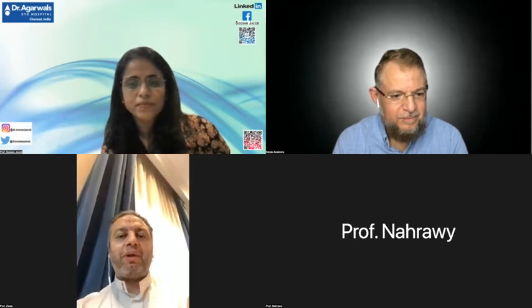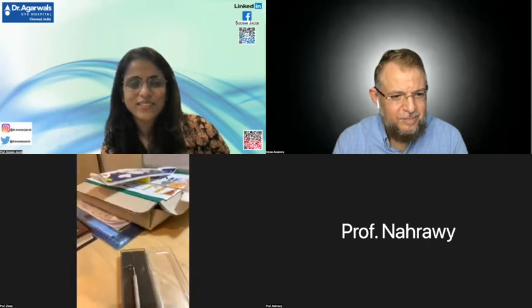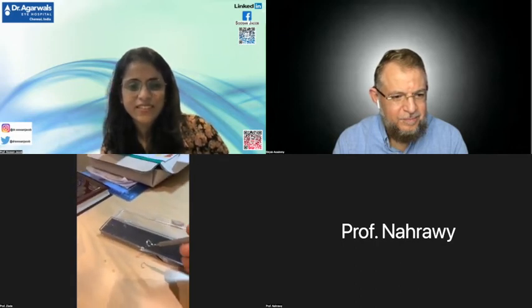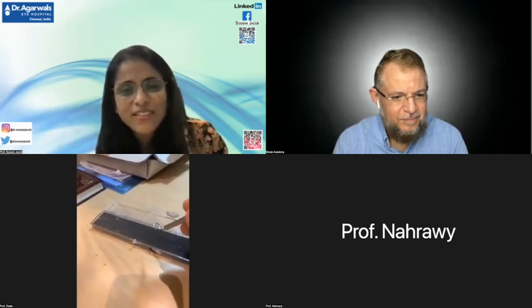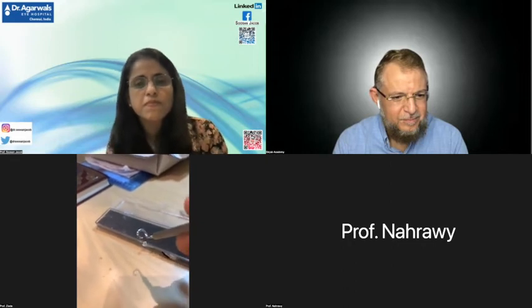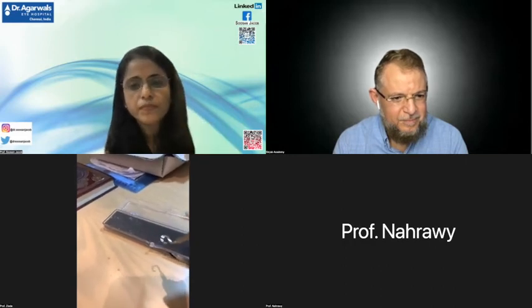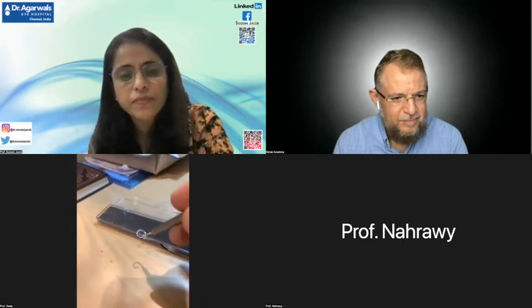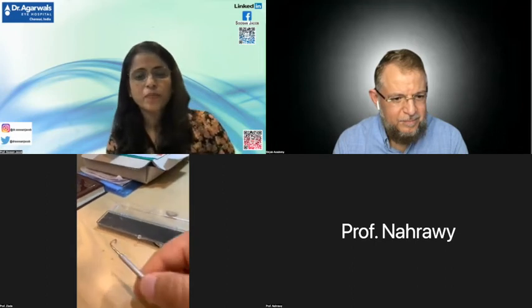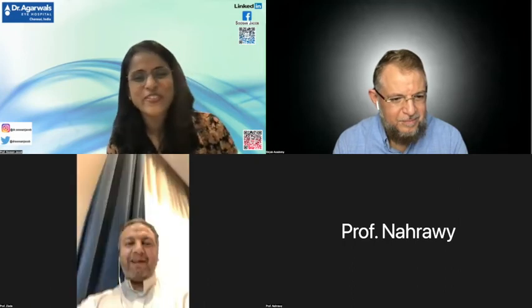I would like first to assure you that I'm still keeping your dissector. You asked me about what I have, and I will show you now this dissector, which is a handmade dissector. It's actually made just for you on your request. This dissector is for the CAIRS. It's not for the usual or the traditional intracorneal ring segment. This dissector is broader and bigger than the other one. Its width is around 2 millimeters, with an inner diameter of 5.5 and outer diameter of 7.5, and it's bidirectional for both sides. So I'm still keeping it for you. Don't worry about it. Thank you so much. I'm looking forward to getting that in my hands and using it.